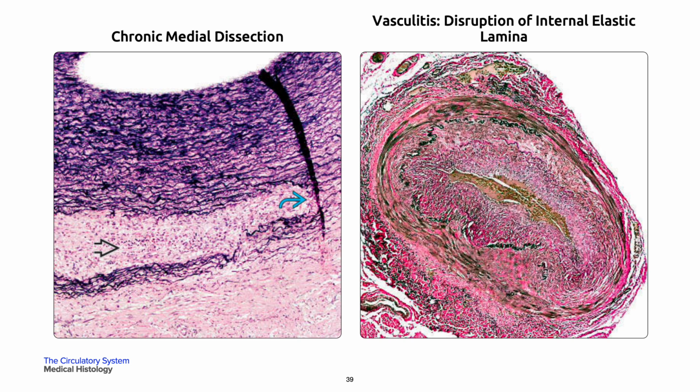On your right is a markedly abnormal vessel showing an important hallmark of inflammatory damage caused by vasculitis. The inflammation causes discrete breaks in the internal elastic lamina, and there is replacement of smooth muscle with collagen and fibroblasts, or fibrosis.